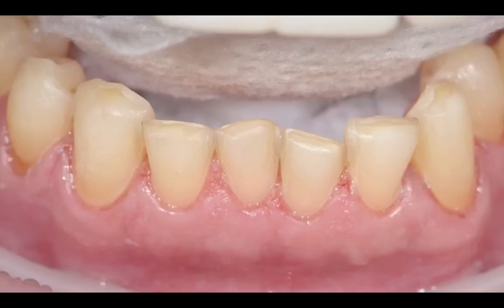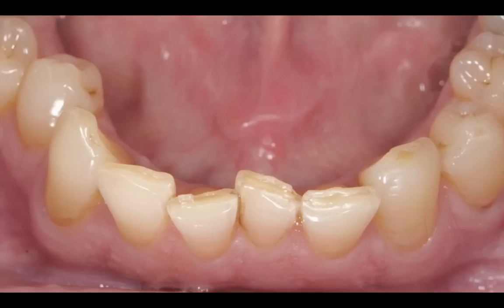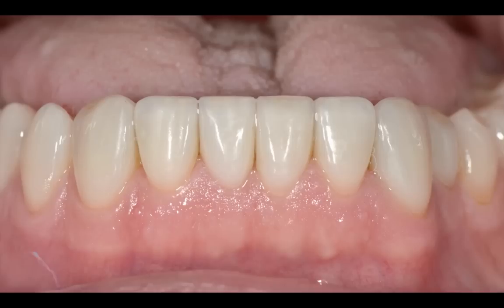That shows how we evened out the arch form — we were able to even it out without aggressively over-preparing the teeth and without even breaking contact. I didn't break contact on any of these. I typically don't with veneer restorations because I'm trying to save and preserve as much tooth structure as possible. From the frontal view, these look nice and level and even now compared to what they were when we started.